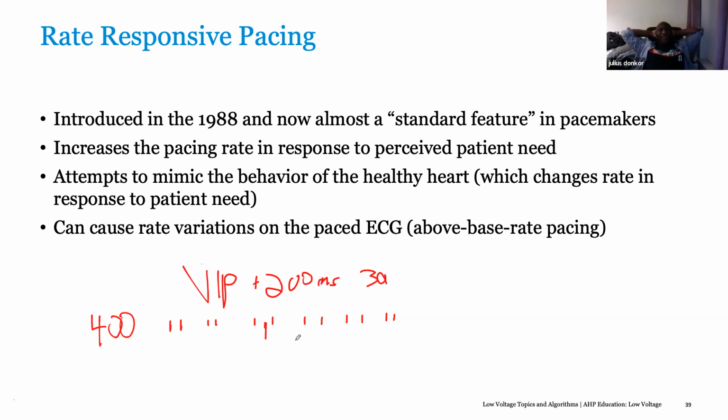it will basically sense the AV node, just like VIP, and within a few cycles, it will sense whether the AV node is conducting, and if it finds anything intrinsic, then you will just leave it alone and continue to support the atrium. So if the patient goes into complete heart block, then it will just go into DDD mode, like AJ was saying.